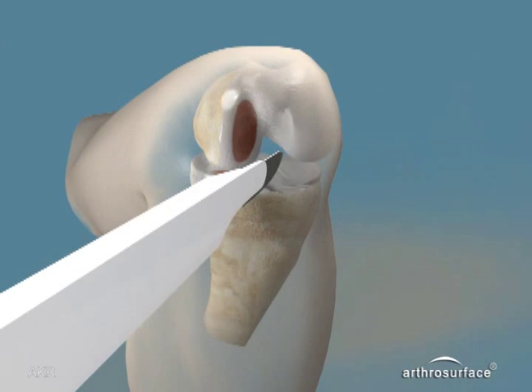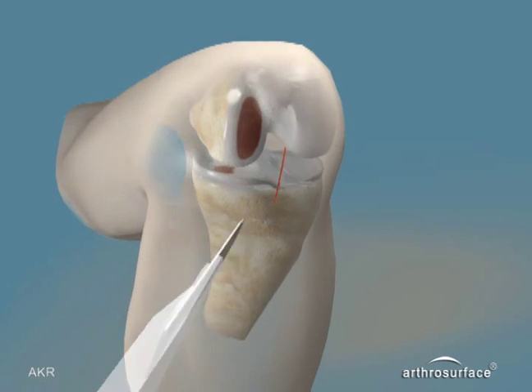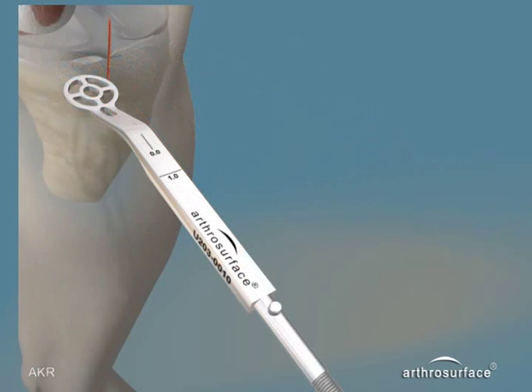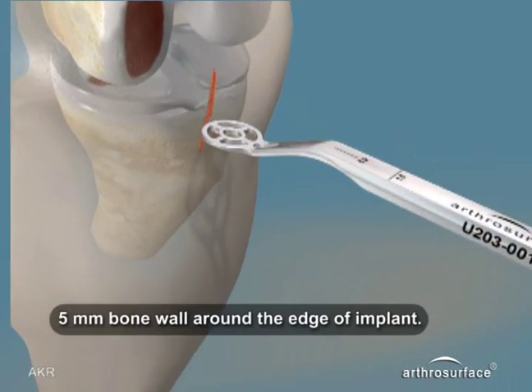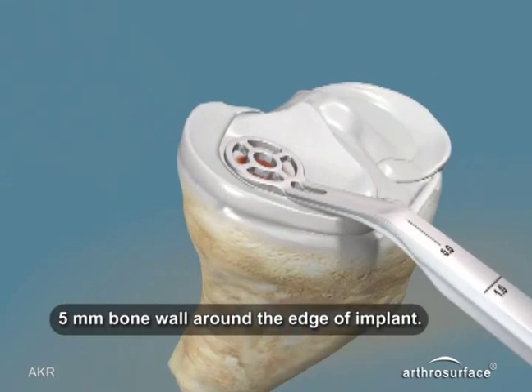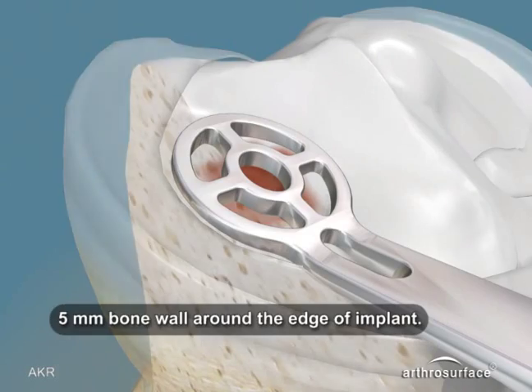We will prepare the tibial side first by making a portal a little larger than a standard ACL portal. Select a template and place it over the defect. You must leave a 5mm bone wall between the anterior tibia and the template, and also the medial wall and the medial side of the template.